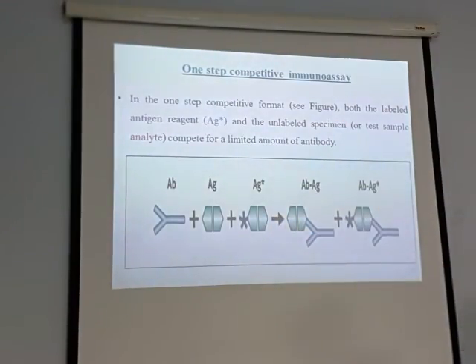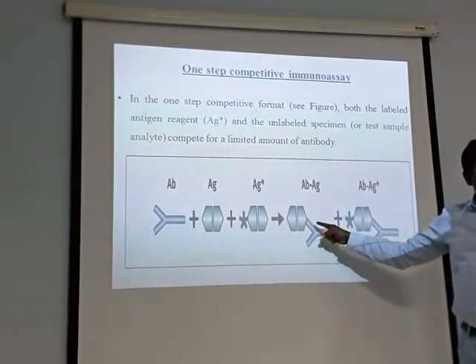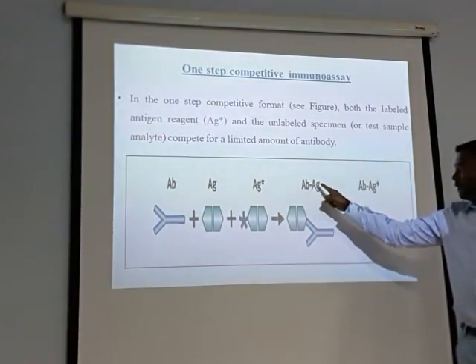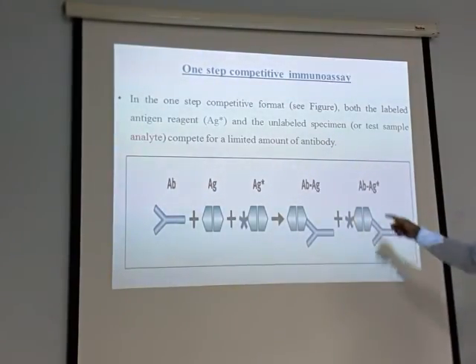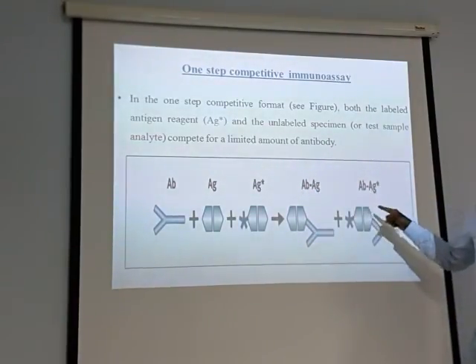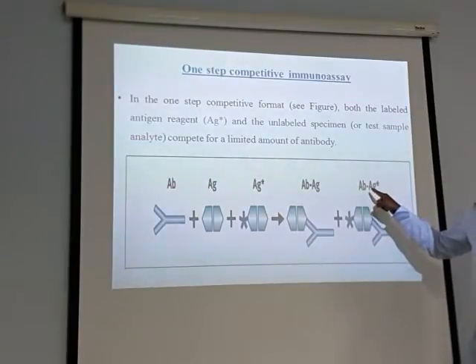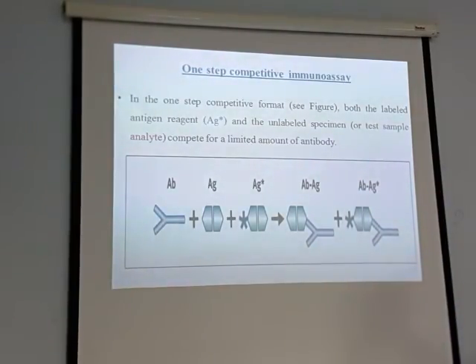So when the test goes, it will form either an unlabeled antigen and antibody complex, or a labeled antigen and antibody complex. If the test indicates labeled antigen and antibody, it means the sample is negative.